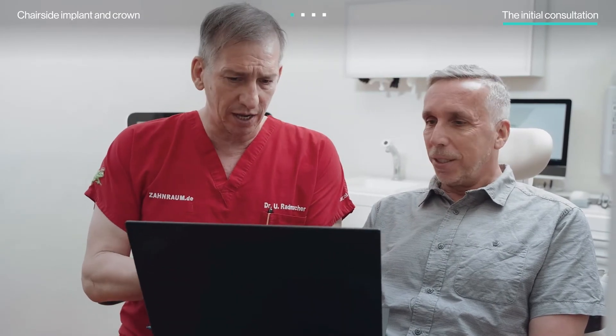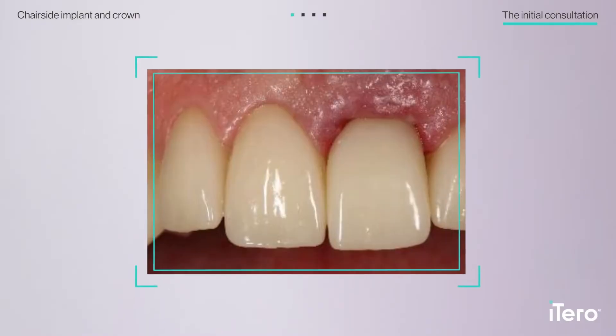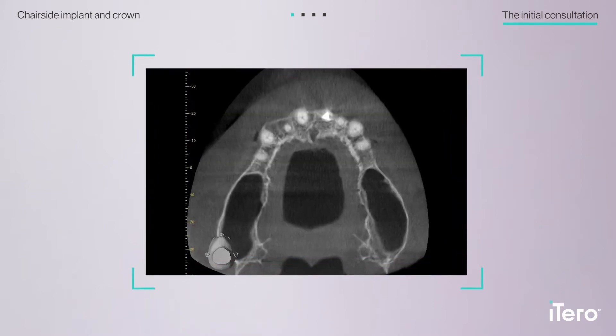In addition to scans, Dr. Radmacher collected other digital documentation for surgical and restorative case planning, including photographs, x-rays, and CBCT imaging.